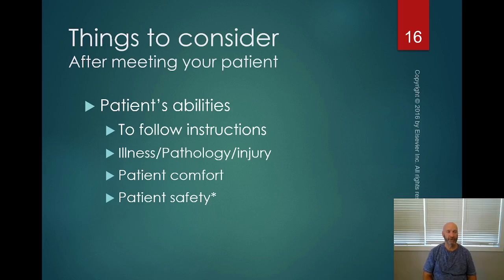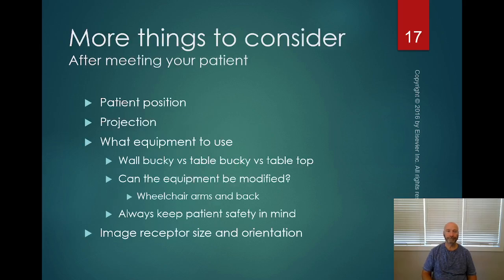So make sure you consider the patient's safety. Put the side rails up if they're on a stretcher. Lock the wheelchair. Don't put them on a rolling stool if you think that the stool might get out from under them.